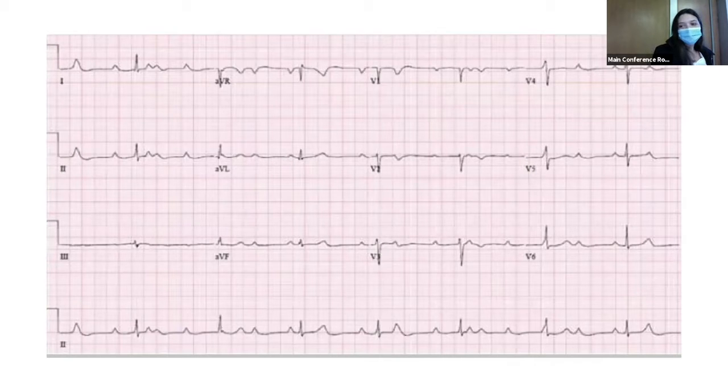All right. So heart rate around like in the 40s. Rhythm, like a block. And they're not congruent with each other. So it's like the axis is normal axis. No ST elevations.